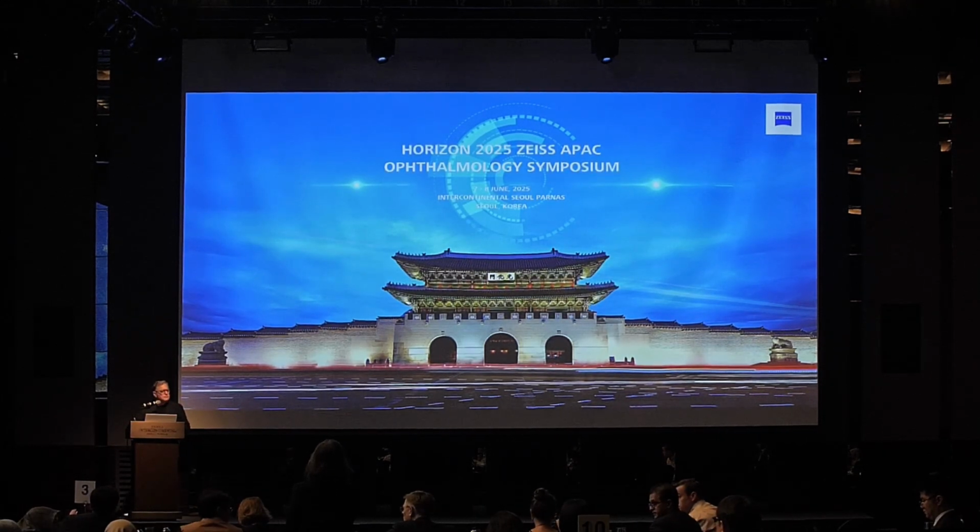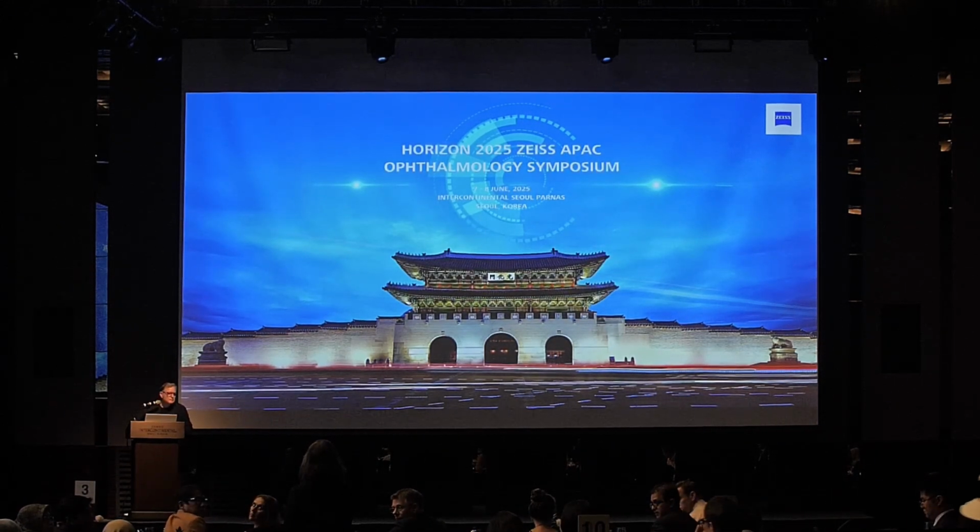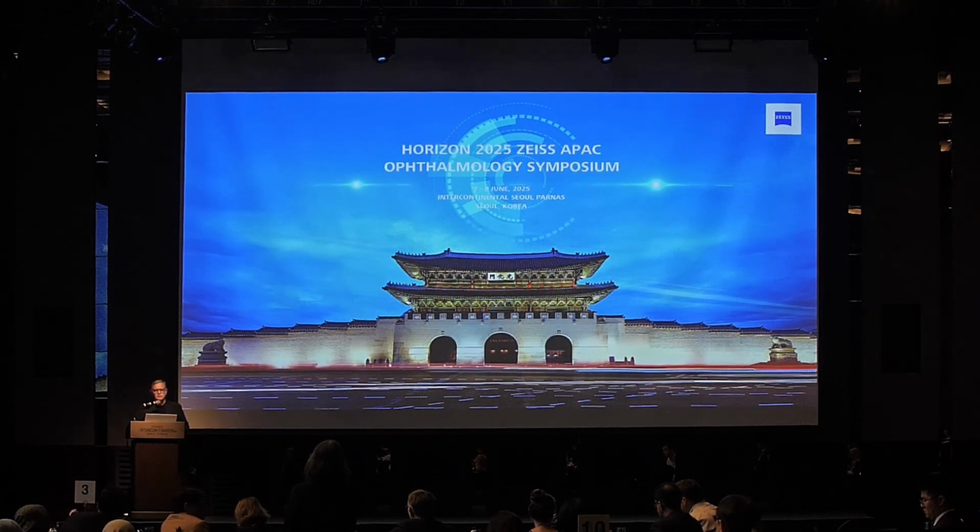Thank you for the excellent presentation. So my question is, your threshold for putting a multifocal toric is a cylinder of 0.75 diopter, and then you put a toric multifocal in all cases, is that correct? Yeah, I usually look at the situation and more at the expected postoperative astigmatism.